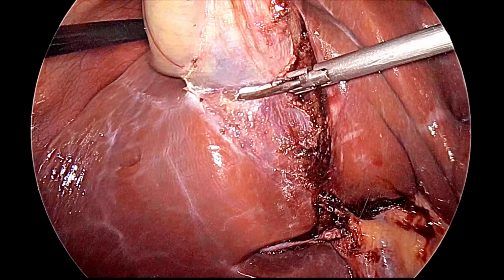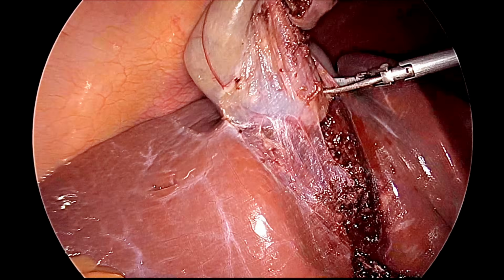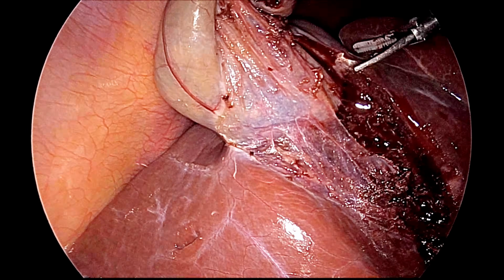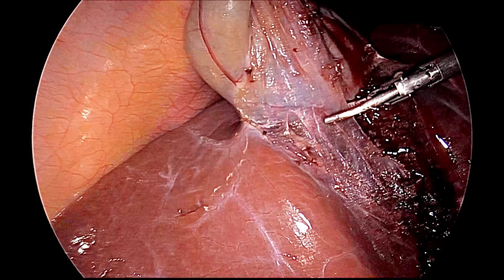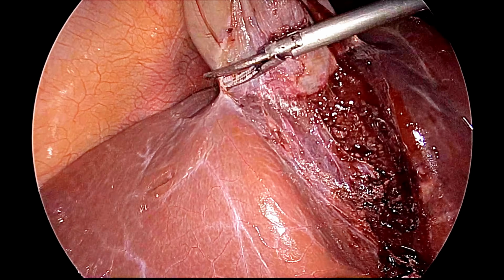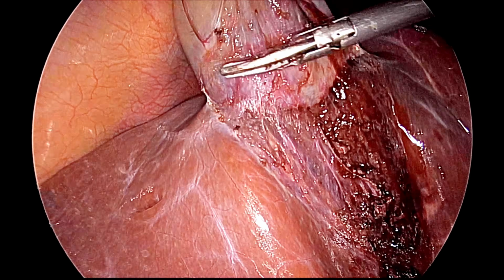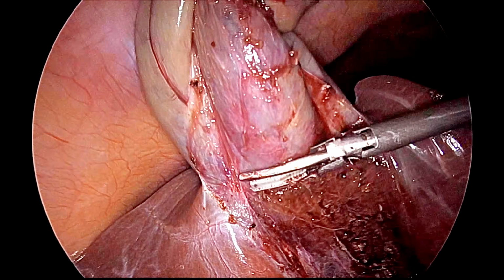Right now the light cable of your 30 degree camera should be down, and then the fundus grasper is removed because now it is not necessary, and the final dissection of the fundus of the gallbladder will be carried out. It should be a combination of gentle traction and blunt dissection. Only the peritoneum you should try to cut sharp, and slowly the final dissection is carried out.